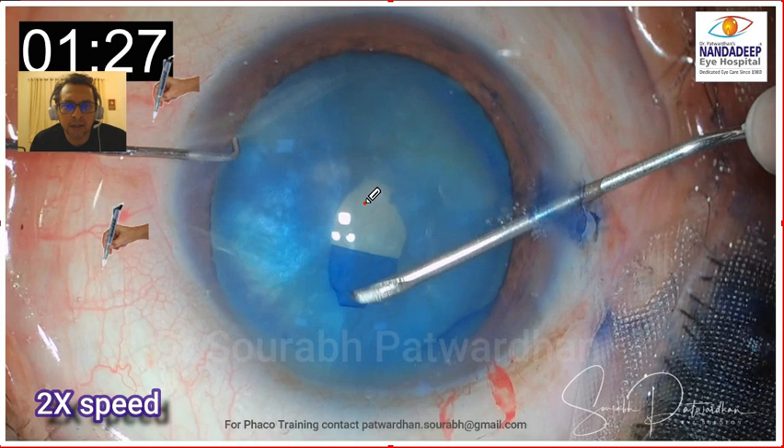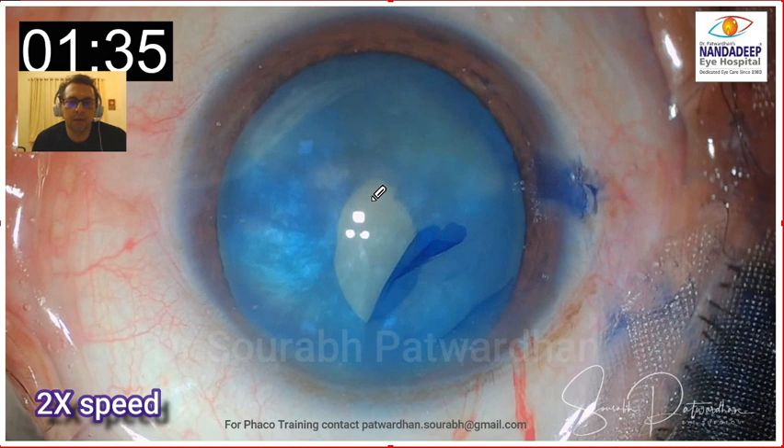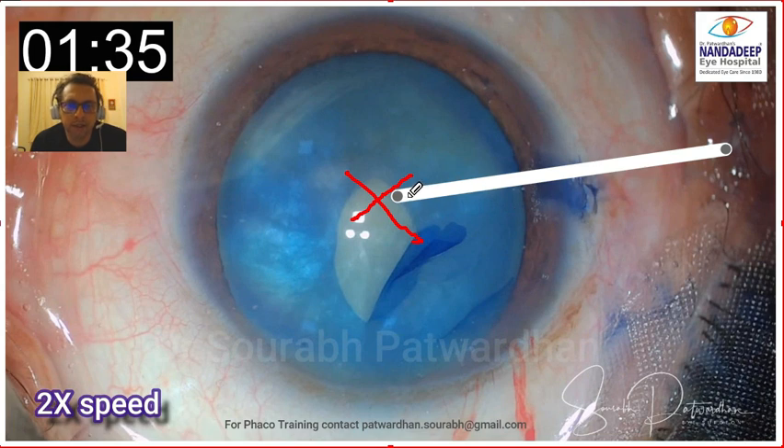Now about the first nick: what the surgeon did here — the nick started right in the center, which is good, and then the surgeon extended that tear towards the periphery, which is again perfect. But I think the surgeon went a little bit too far. I might have just stopped somewhere here. What I might have done instead is a cruciate incision, so that there is no single tear where the intralenticular pressure, which is high, will exert its force.